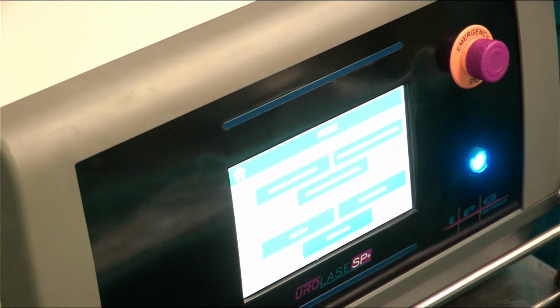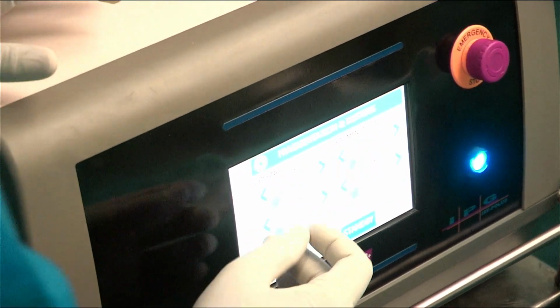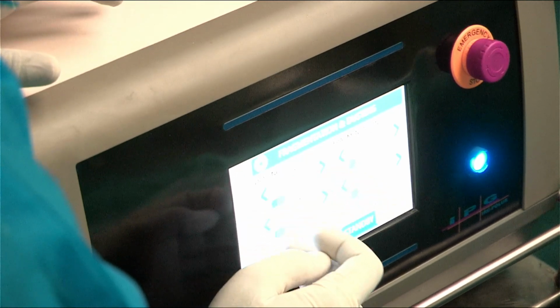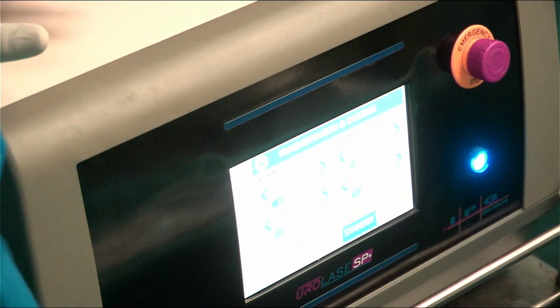I think, Dr. Sajad, for the kind of stone we are seeing here, dusting is a better option. Yeah, you'll be wasting time otherwise. Exactly. So there are 2 options for me. Either I just go and fragment it and take all the pieces out, or I do a dusting. So the choice is yours. So what should I do? Dusting. Okay, fine.